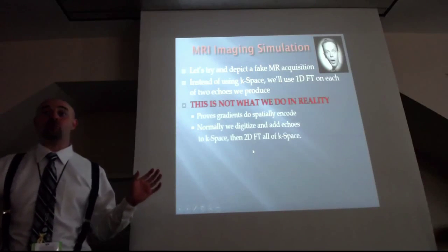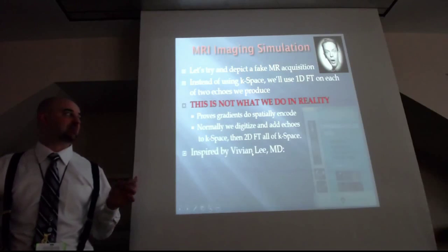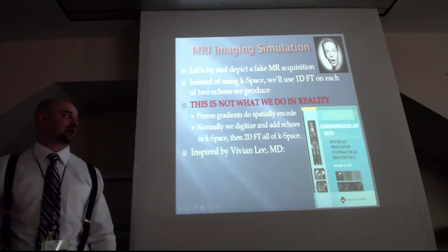Again, normally when we get an echo, we digitize it, add it to K-space, and then we do a 2D Fourier transform of all K-space.